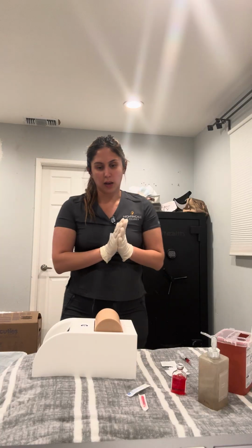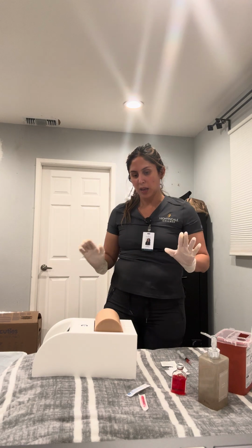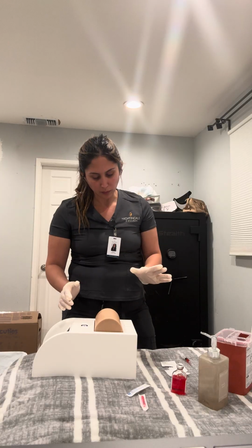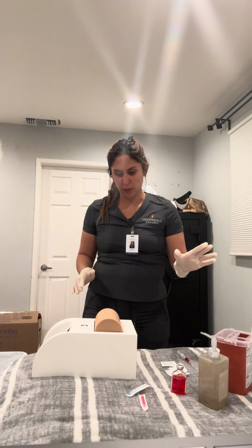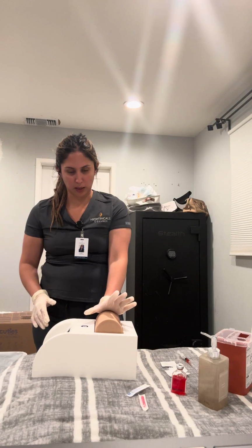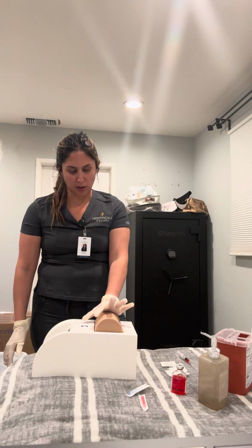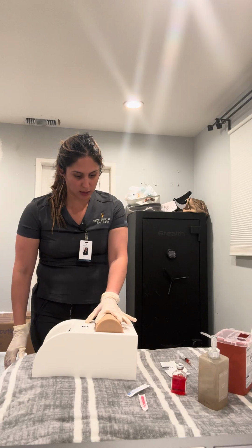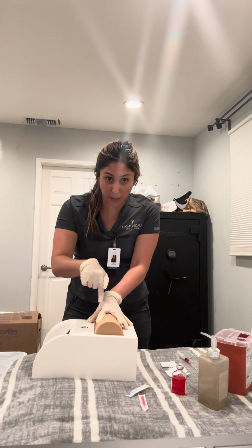If this is okay, I'm just going to confirm with the patient. I'm going to put them in a comfortable position. I'm going to have them turn to either their right or left side, on their hip. I have the patient lying laterally, and I have their hip. I'm going to put my palm on the greater trochanter, point my thumb towards the patient's groin, my index finger towards the anterior superior iliac spine, and my middle finger towards the iliac crest.